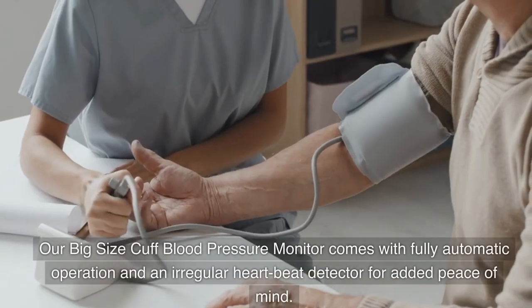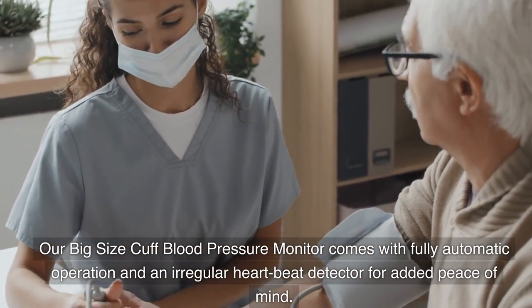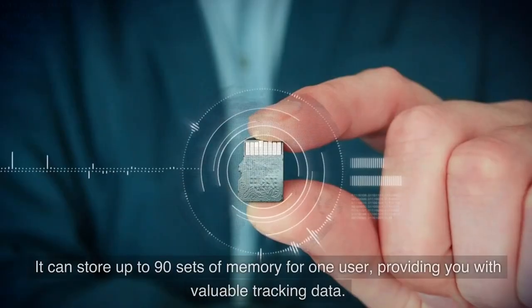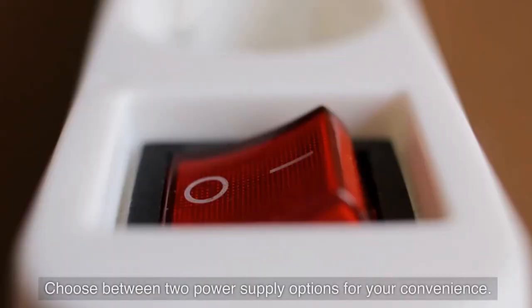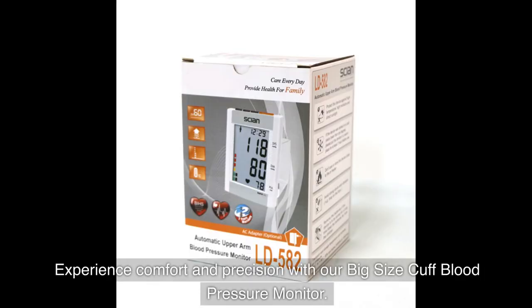Our big size cuff blood pressure monitor comes with fully automatic operation and an irregular heartbeat detector for added peace of mind. It can store up to 90 sets of memory for one user, providing valuable tracking data. Choose between two power supply options for your convenience.